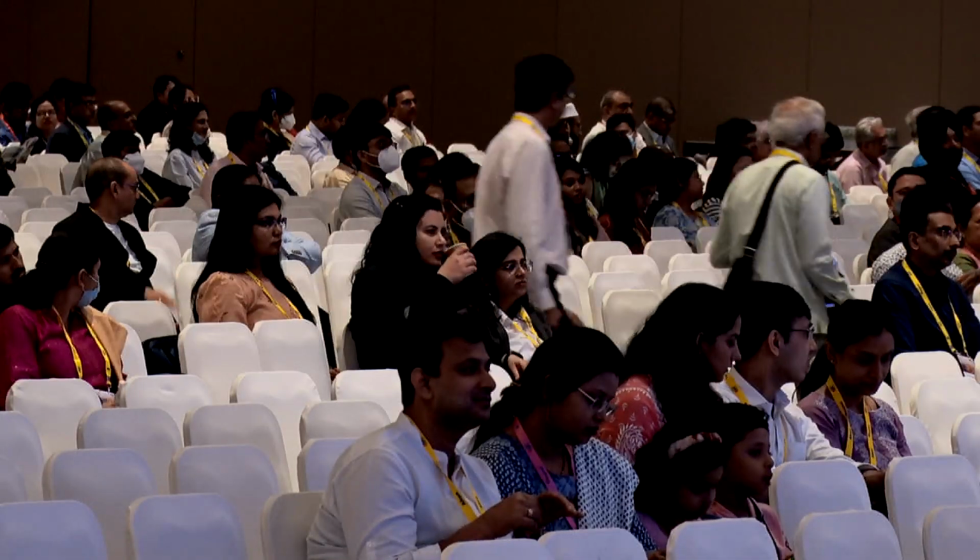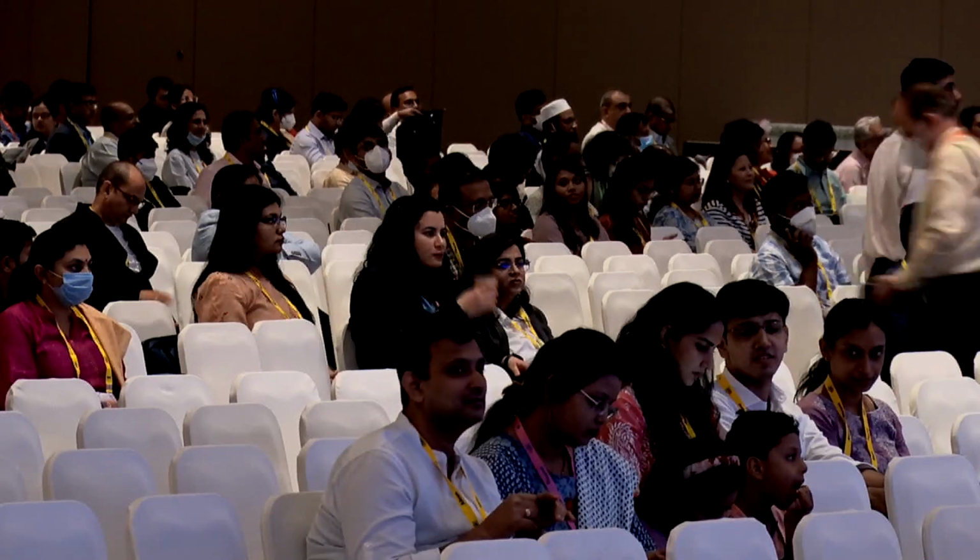Thank you, Dr. Mahipal, sir. And we know that hard cataracts can be very difficult to manage sometimes, but looking into a basic aspect of managing cataract, if you look into the hardness, do a proper technique, safeguard the endothelium, most often the results are very gratifying in these cases also. And femtosecond laser would definitely be advantageous in these cases also. If you can at least make a nucleus softer, then subsequent energy use will be less, and damage to the endothelium and the surrounding uveal tissue will also be less. So effectively, it has not only an intraoperative advantage, but an advantage in the post-op period also, where inflammation will be less in these cases.